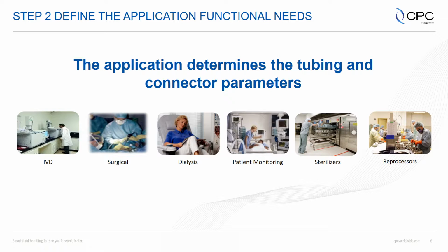Patient monitoring is another application where we're talking about low pressure air, probably not using a valve, but ease of use, small size is much more important. So these are all just examples of applications where when we start understanding that, it starts to drive the connector needs.